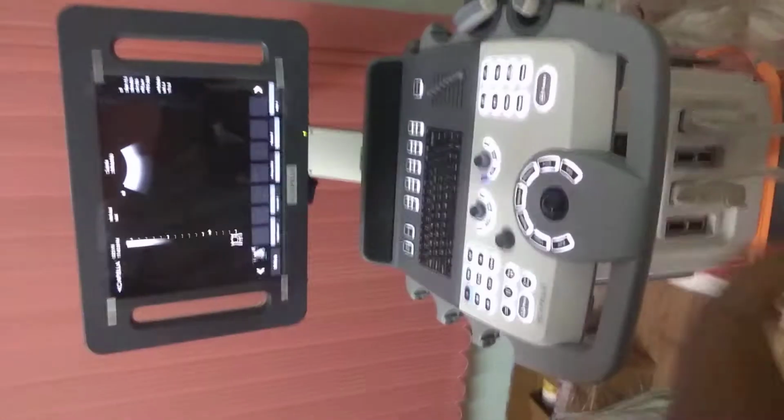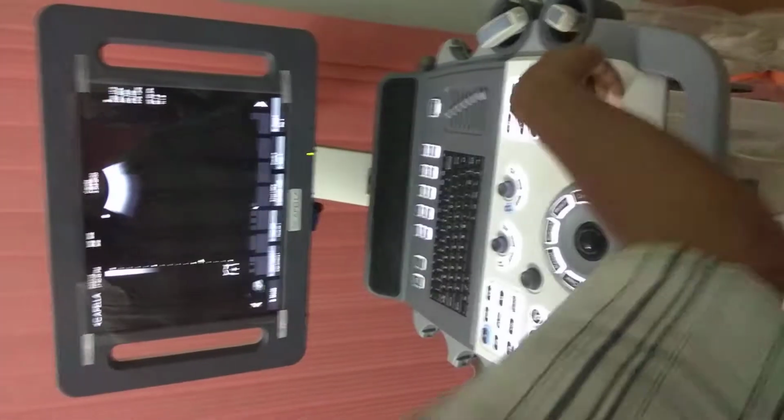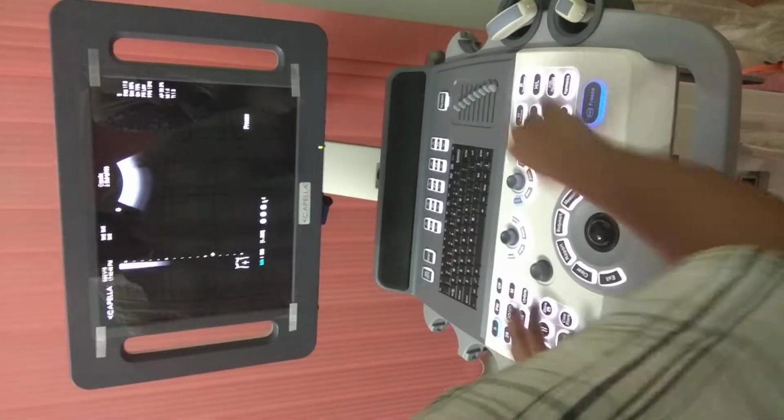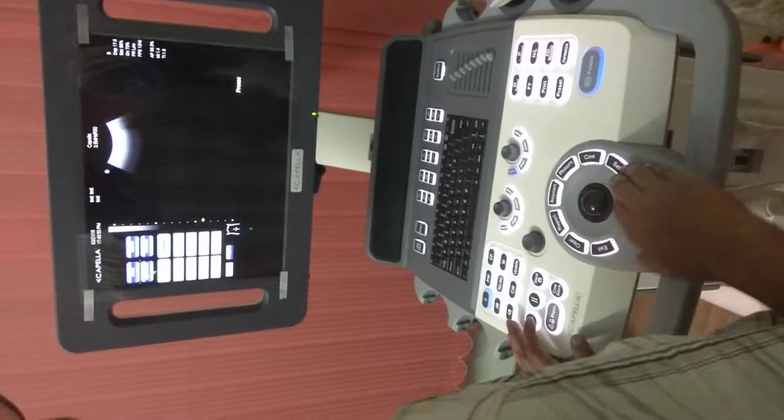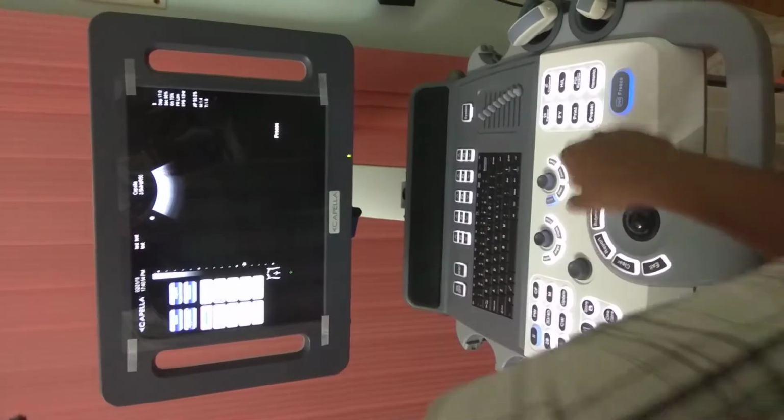So now what we are going to do, we are just going to see some dummy measurements so that we can see how to create an OB report. We first freeze the frame and we press the measure button. We select the OB application. There are two parts, early and later obstetrics.